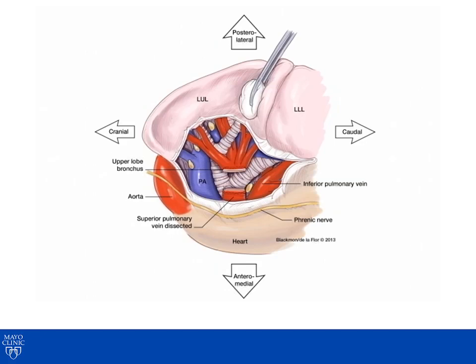You first begin by dissecting the superior and inferior pulmonary vein structures. You want to divide only the left upper lobe superior pulmonary vein structures. Make sure that you have an inferior pulmonary vein and that you are not ligating both branches.